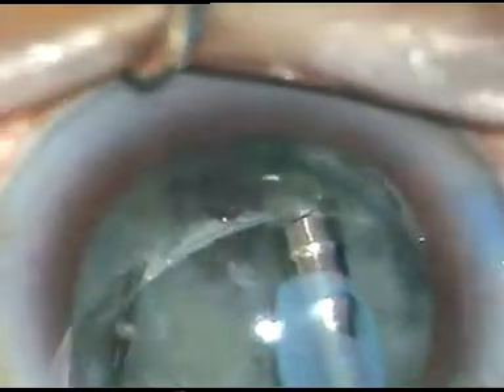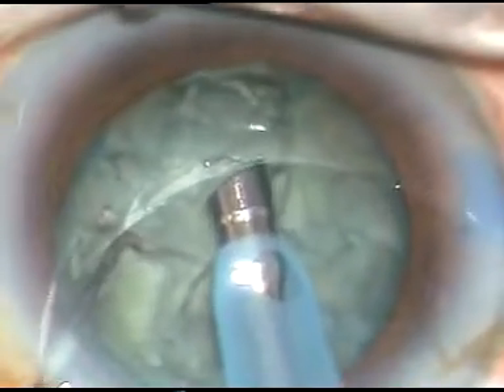This is a nice depth. If we apply opposite forces in each trench, it divides so nicely — the nucleus has been divided into four almost equal parts. I now go to FACO2 mode and each nuclear fragment is emulsified and taken out. Trenching was done in FACO1 mode with phaco power 70%, flow rate 25%, and vacuum 50 mmHg. In FACO2 mode, phaco power is 65%, flow rate is 45 ml per minute, and vacuum is 450 mmHg.